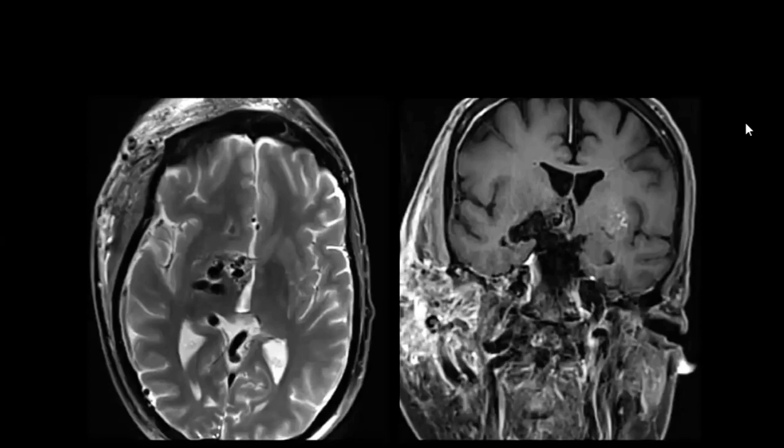Loss of signal is also seen on the coronal view. No perilesional edema is noted. The lesion is confined to the deep white matter. No hydrocephalus is seen. On coronal images, there is hyperintensity on T1 weighted images.